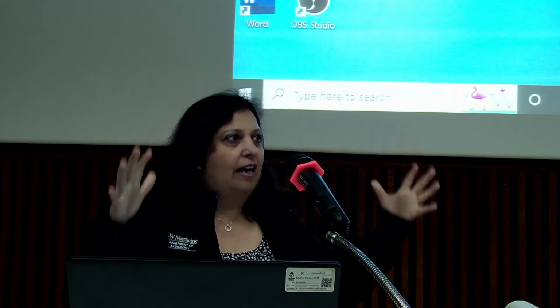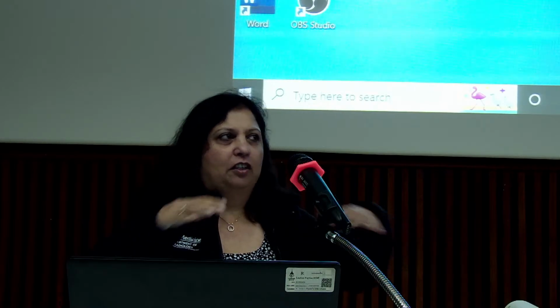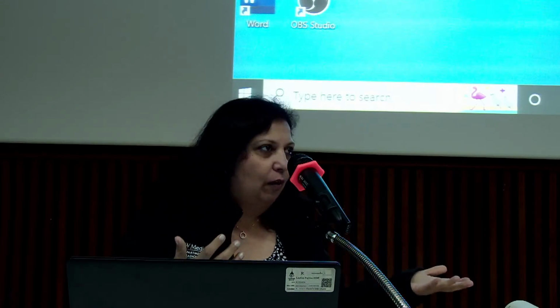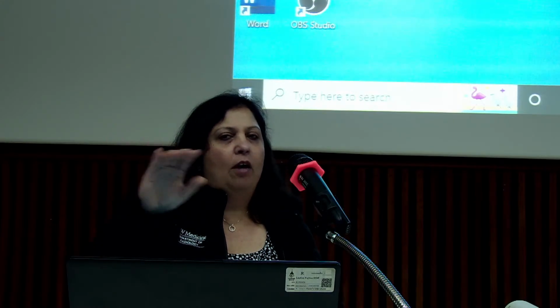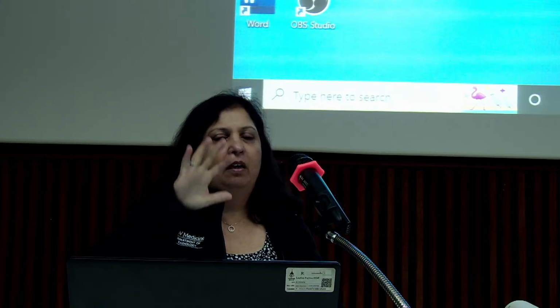So we decided across cardiology, radiology, and electrophysiology that we would pick 5 gray. But at a children's hospital, you might do more like 2 gray because they're children, or even 1 gray if you want to be conservative. You could pick whatever level you want, but really the irreversible tissue reactions happen after 5 gray.